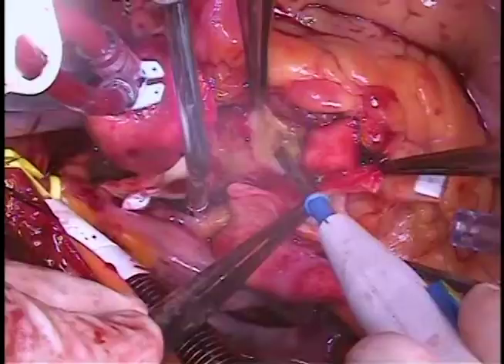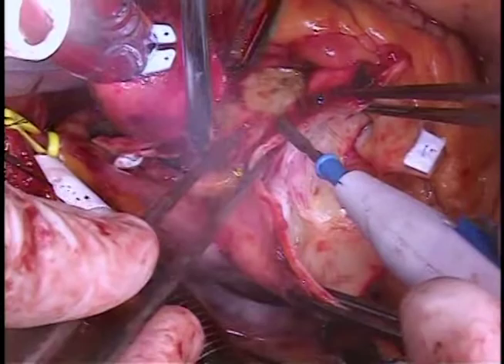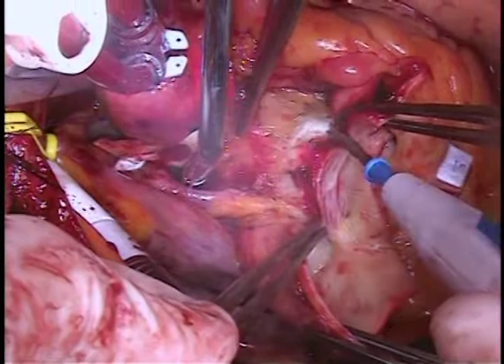This low dissection is one of the reasons why it can be a little more challenging to do this procedure in a reoperative setting, because there's a lot of scar tissue around here that sometimes doesn't allow you to get as low as you would like. But it is possible.